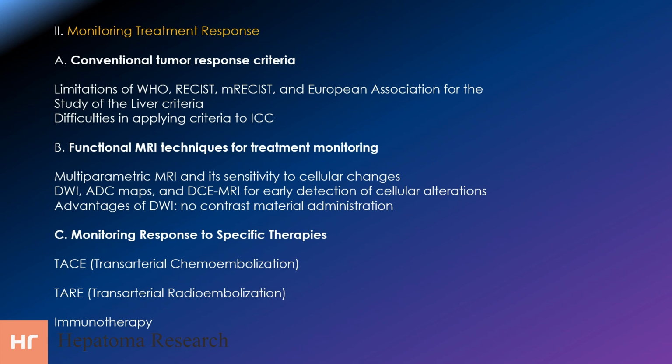For monitoring the response to transarterial radioembolization, radiomics-based quantitative features obtained from baseline CT scan can help identify ICC patients most likely to respond well to the treatment. Dosimetry, the measurement of radiation dose, is an important aspect of TARE, and intraprocedural MRI-based dosimetry has shown promise in providing real-time insight into microsphere distribution during TARE.